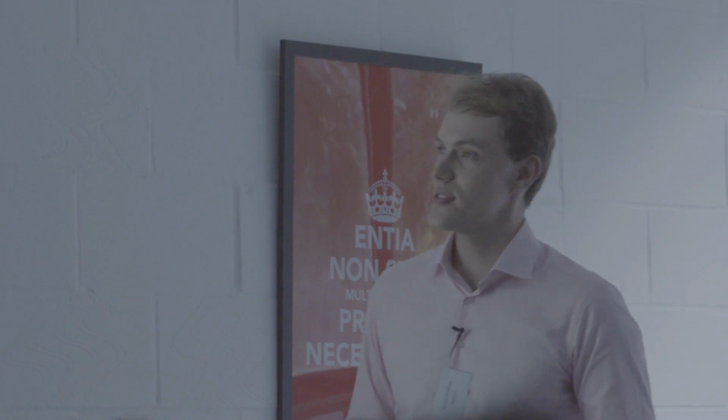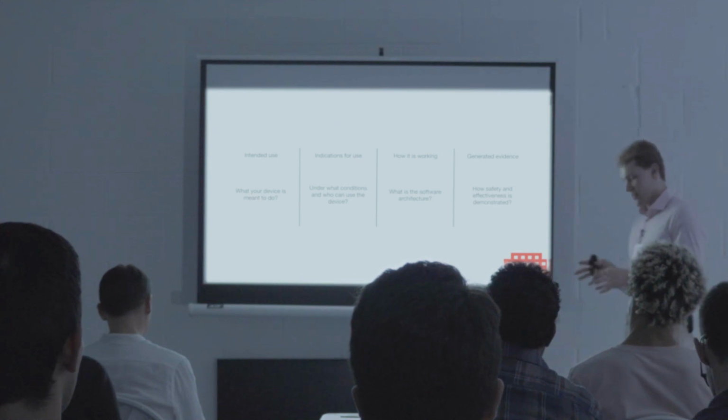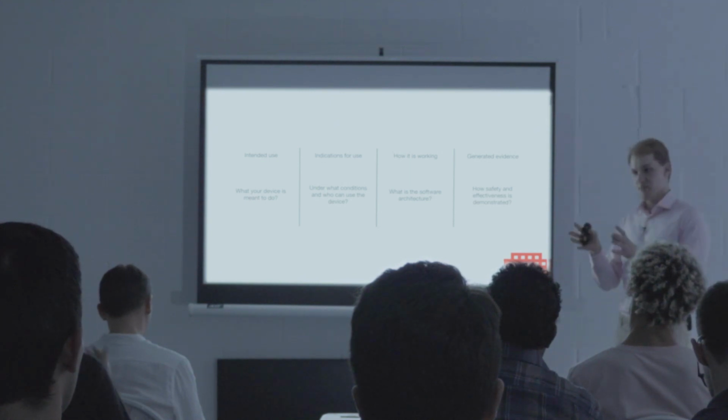So is it a screening tool? Are we measuring abnormal movements? That's what we generally do here in Parkinson's disease, for example. We're measuring how severe a patient is, how affected the patient is. Indications for use is who is going to use the device, what is a particular target population.